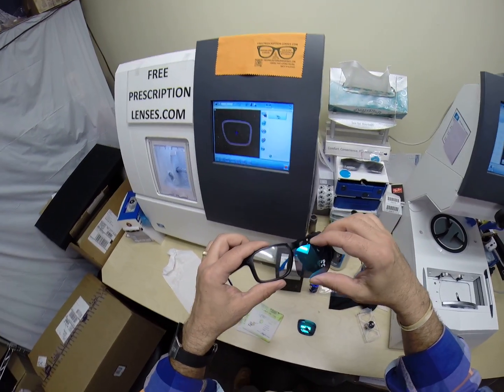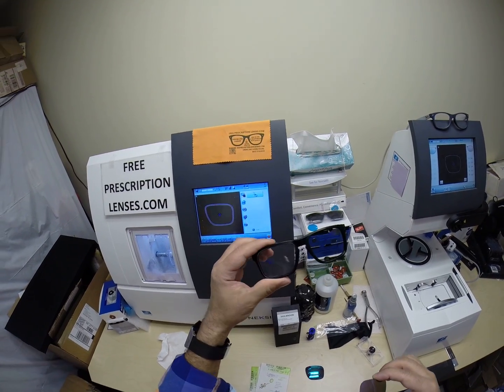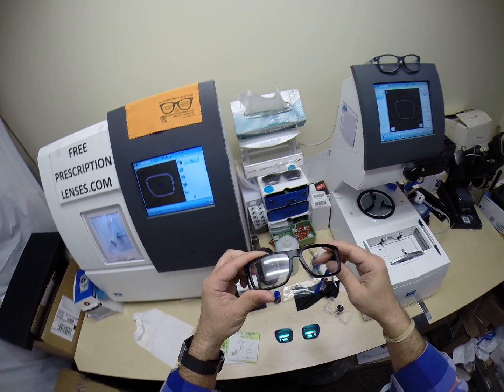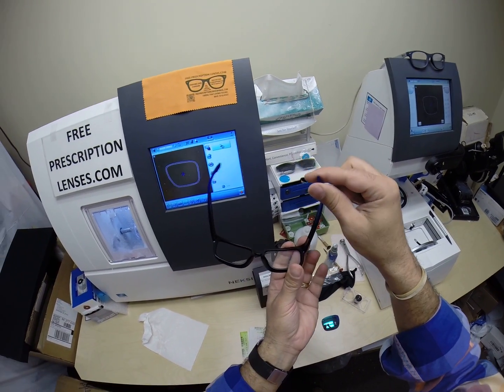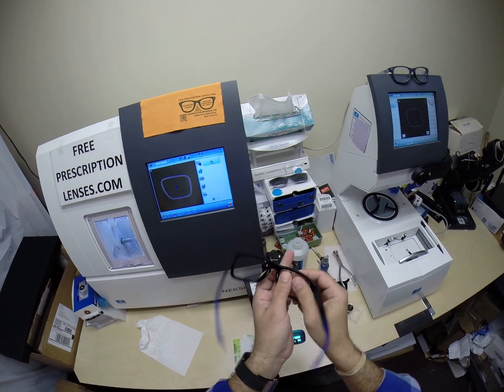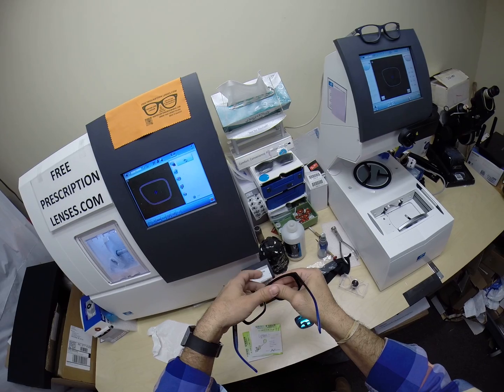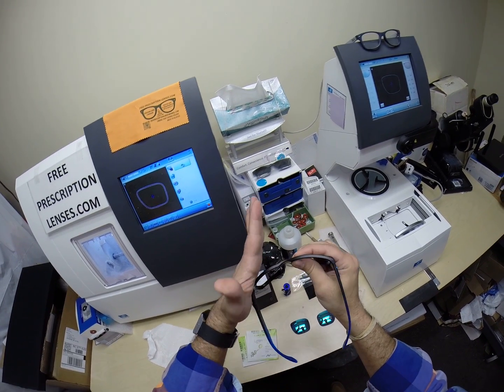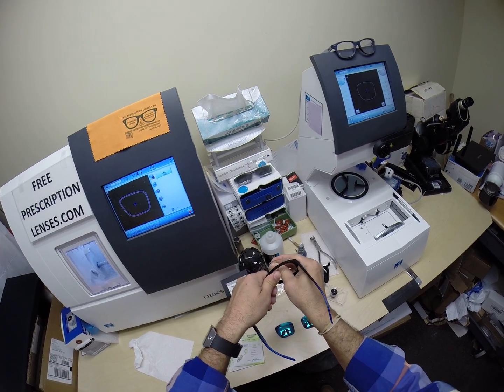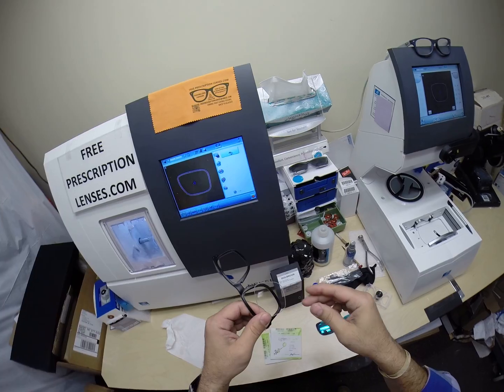So the purpose of this, even though these are both non-prescription, you can wear these as clear everyday lenses, or you can put the sunglass lenses back in. In order to do that, you turn the frame over with the temples. This is the temple tip sticking upward. I put my thumb, I'm right-handed, I put my thumb at the corner of the nose, my fingers on the other side, place my other thumb on top, and slightly with the palm of my hand pressed against the curve, push like that, giving a little bit of curvature to the frame. And that's how they pop right out.